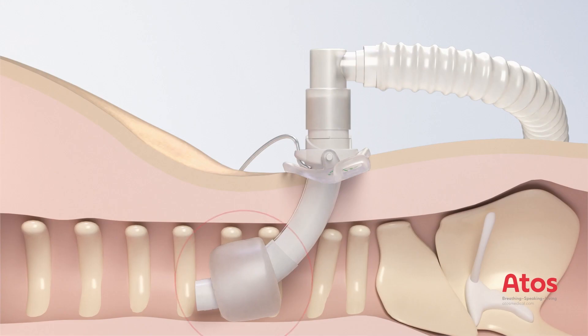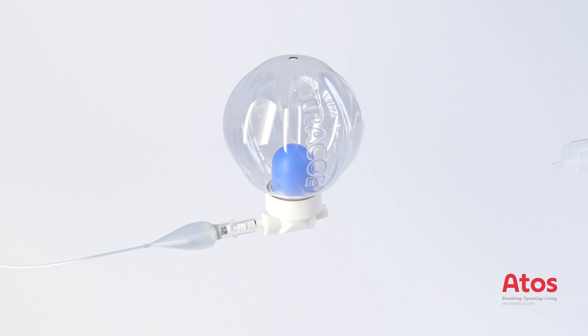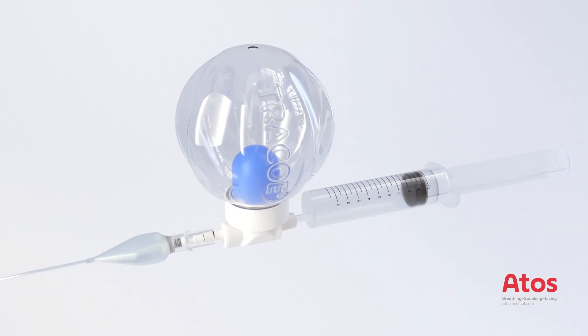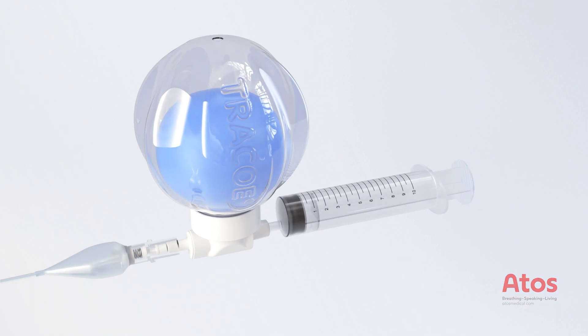Now the cuff pressure should be checked, for example with a handheld manometer. It should be between 20 and 30 cm of water. Alternatively, our Traco Smart Cuff Manager can be connected for continuous monitoring and regulation of the recommended cuff pressure.